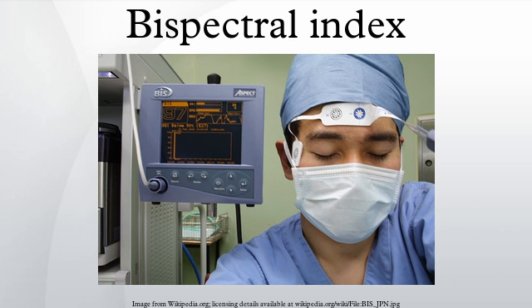Calculation of BIS. The bispectral index is a statistically based, empirically derived complex parameter. It is a weighted sum of several electroencephalographic subparameters, including a time domain, frequency domain, and high-order spectral subparameters. The BIS monitor provides a single dimensionless number, which ranges from 0 to 100. A BIS value between 40 and 60 indicates an appropriate level for general anesthesia, as recommended by the manufacturer. The BIS monitor thus gives the anesthetist an indication of how deep under anesthesia the patient is.